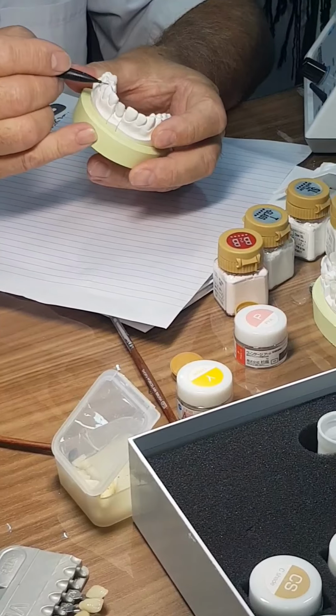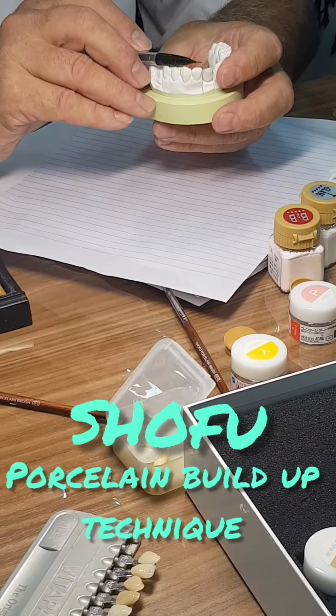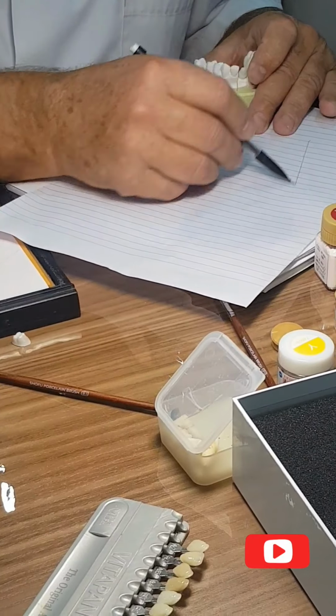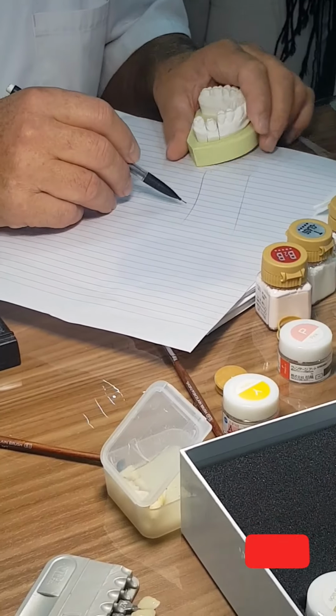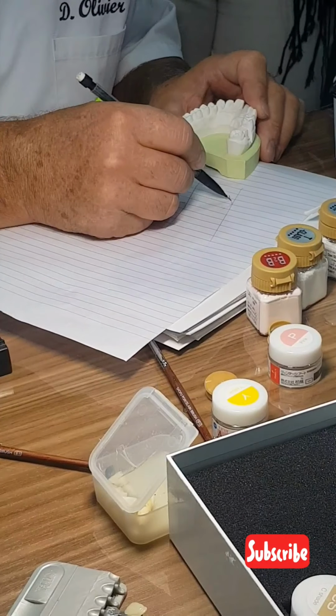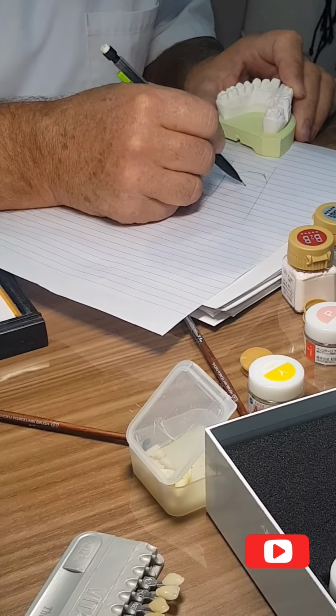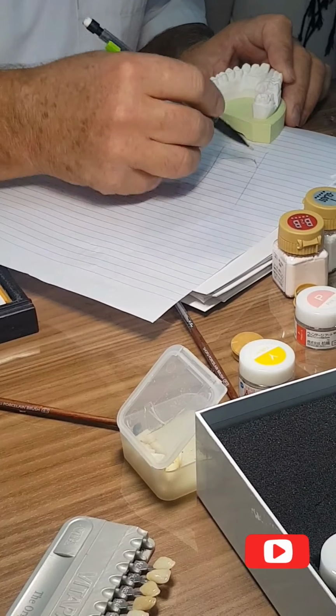Premolar story, you have to draw on the model. You have to draw a lot. I draw a lot on my model to have the answer. I start from one premolar. Two premolar.